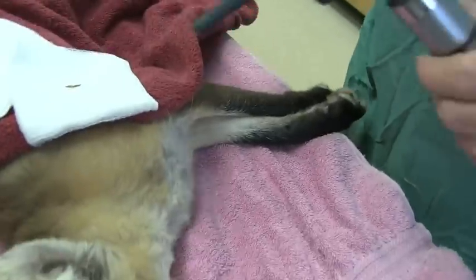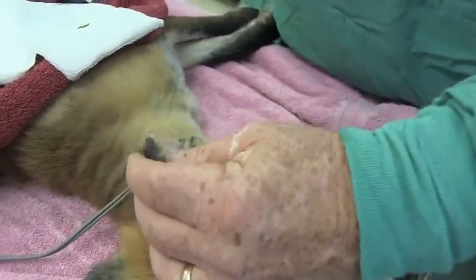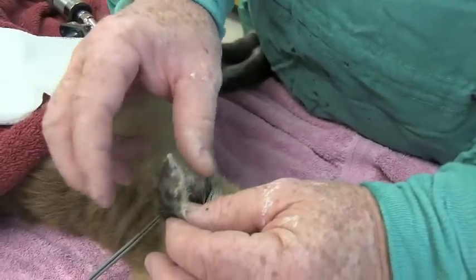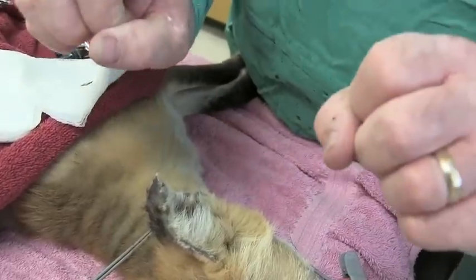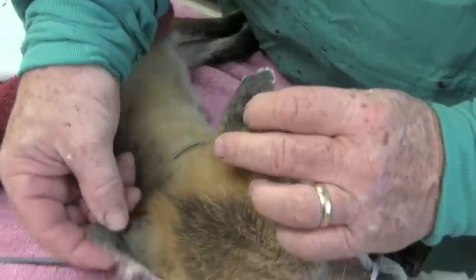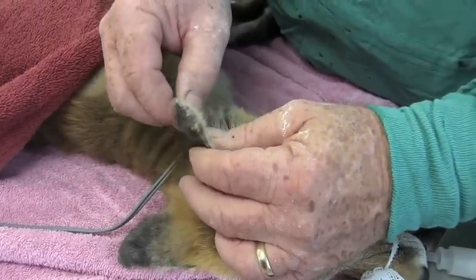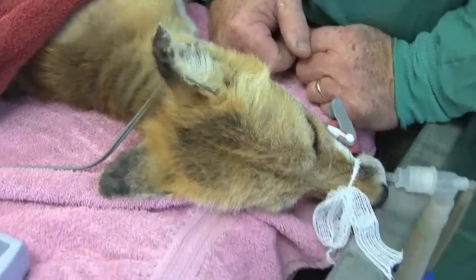Now, will you have to do anything else here? You have to drain fluid? Yes, sir, we do. If this was just left to heal on its own, after several months the body would take the fluid out of there, but the ear would crinkle down like a cauliflower ear. It would be very misshapen. So in order to minimize that, we're going to drain the fluid out of here and put the fox on some antibiotics and some steroids, so that this can heal and the fluid won't come back.